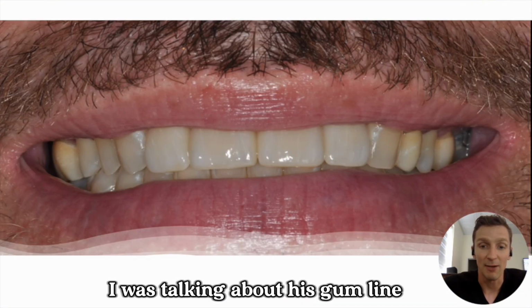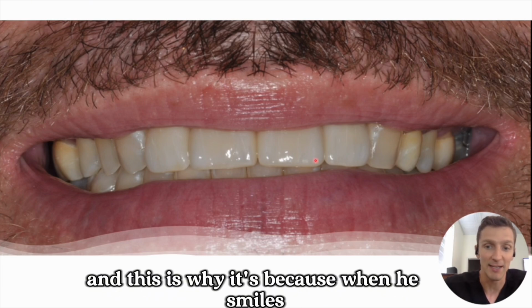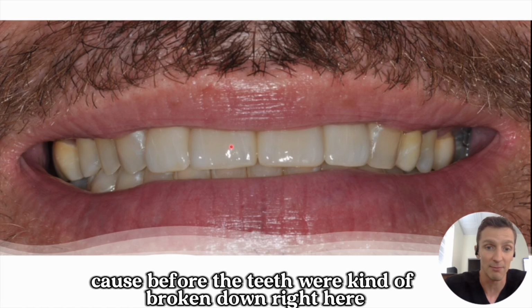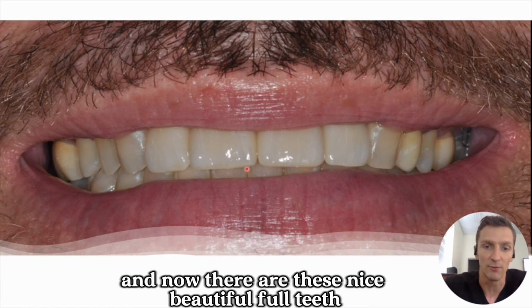Now remember, I was talking about his gum line and why I wasn't too worried about it, and this is why. It's because when he smiles, you can't see up there at all. This is his full smile. And so he was thrilled because before the teeth were kind of broken down right here, right in the very front. And now there are these nice, beautiful, full teeth.